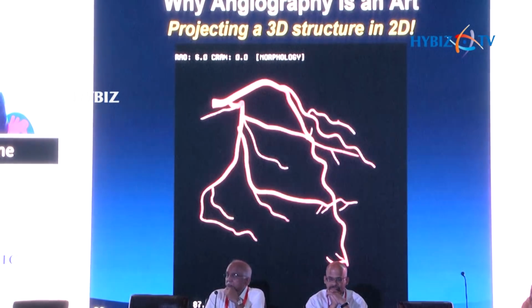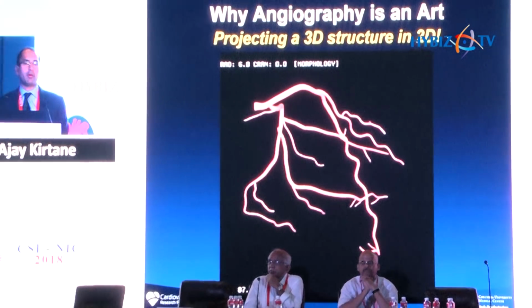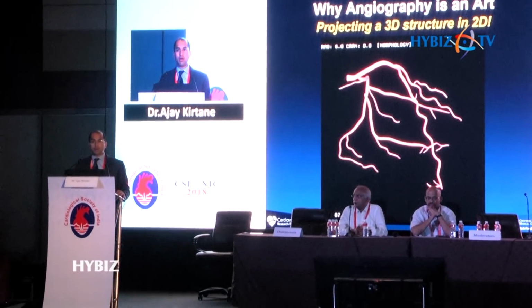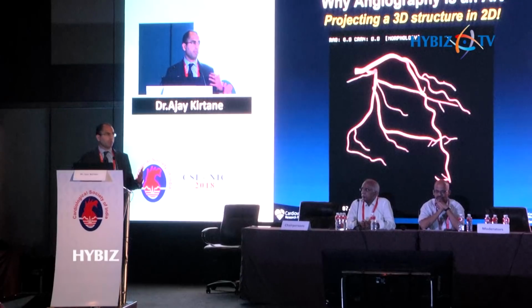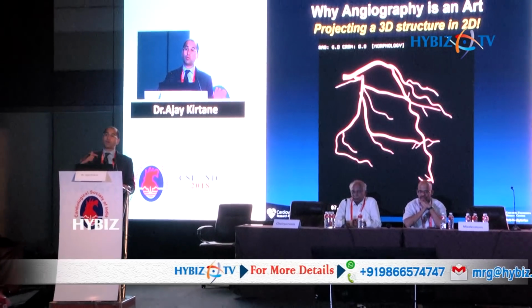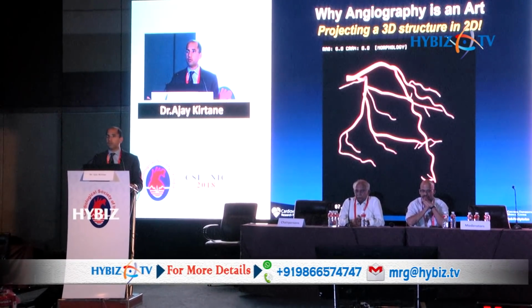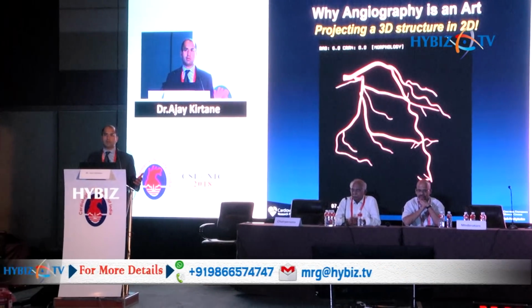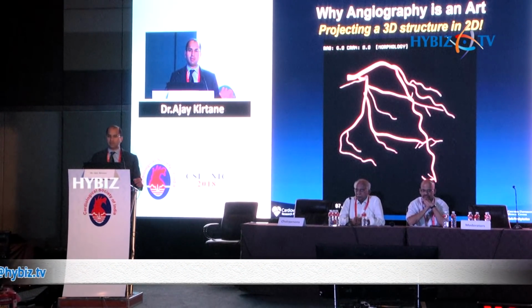I will say in the United States we have a lot of low volume operators, and that situation is not dissimilar to what happens here in India. And also with radial access, I'm a big proponent of transradial, but the engagement is not as crisp potentially as it might be with other techniques, so you have to work harder to get better pictures. And if you take bad pictures, you're not going to be able to take care of the patient in the best way. Bad pictures equals bad patient care.